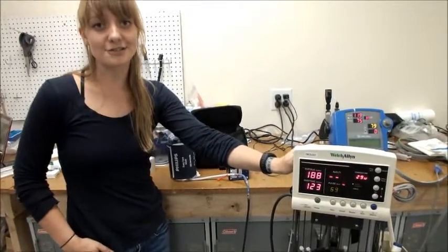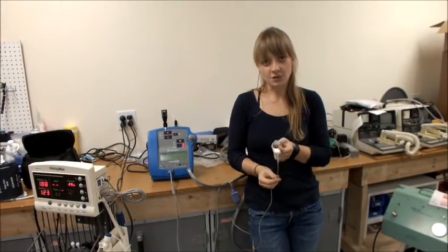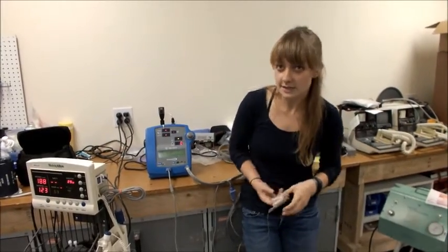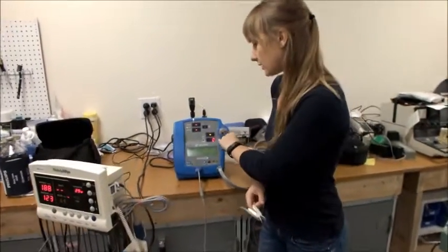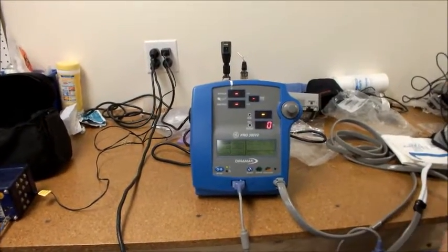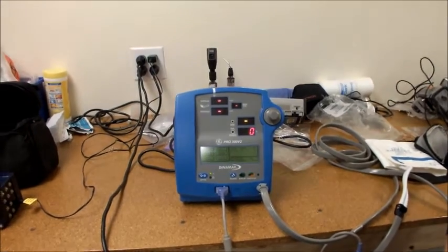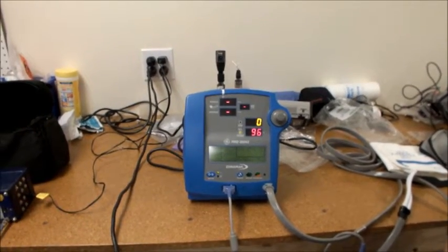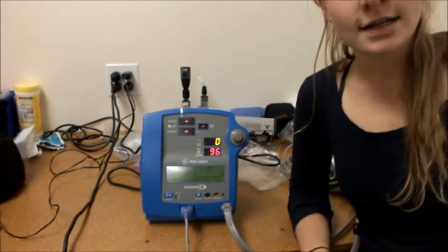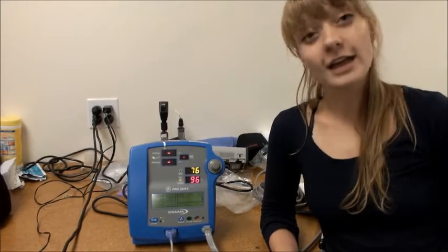Now you're ready to test SpO2. To test SpO2, after double checking that the probe has a red light, simply insert your finger into the probe and keep an eye on the SpO2 measurement area. Sometimes it might take a minute or two to get a reading. As you can see, my SpO2 is 97. As long as the SpO2 value is above 90, the machine is working and you're good to go.